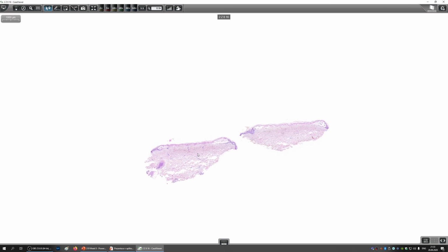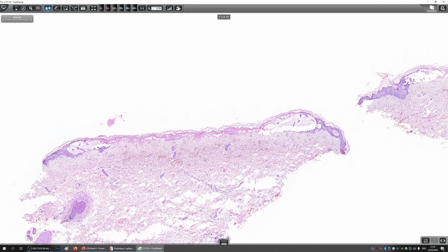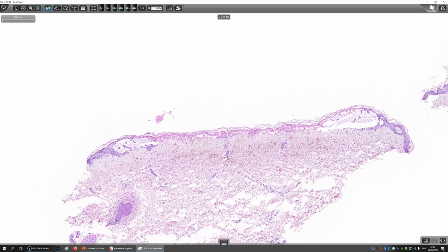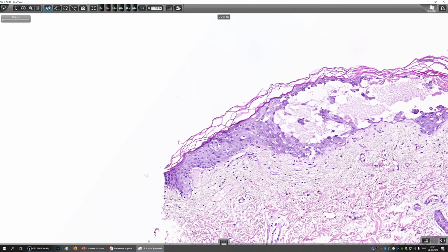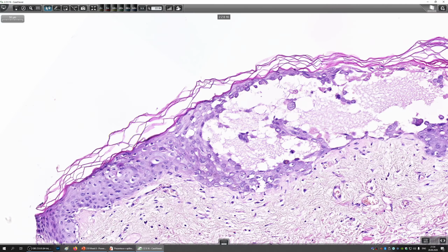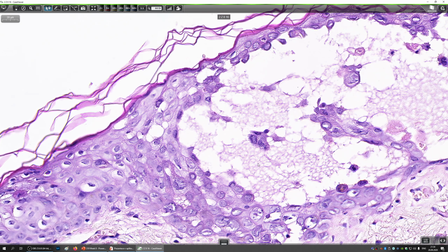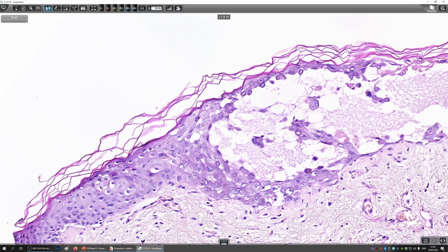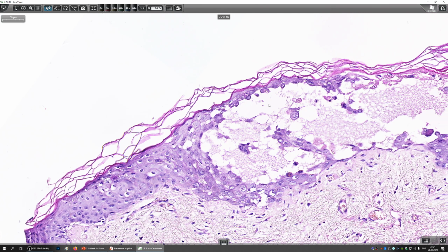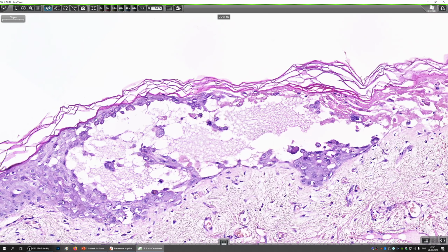So let's just check out the skin. You probably know how a herpes looks like. It's a vesicle. So what happens is that here we have the epidermis. This is the normal one. And if the keratinocytes get infected by herpes, they undergo acantholysis. It means that the joints between the keratinocytes just fall apart and the keratinocytes just scatter like here, and you get an intraepidermal blister here.